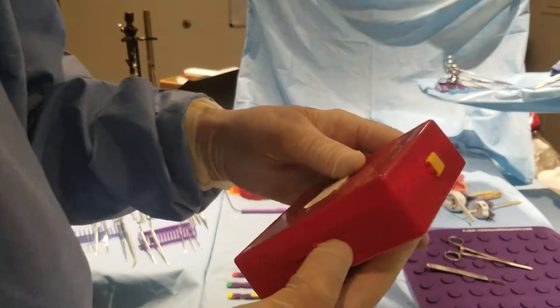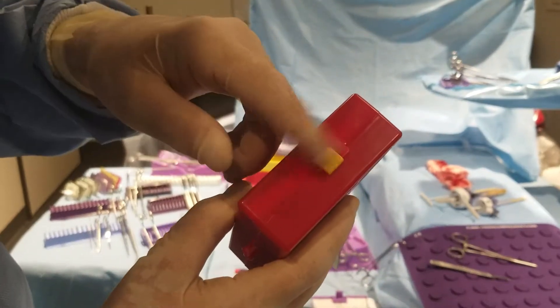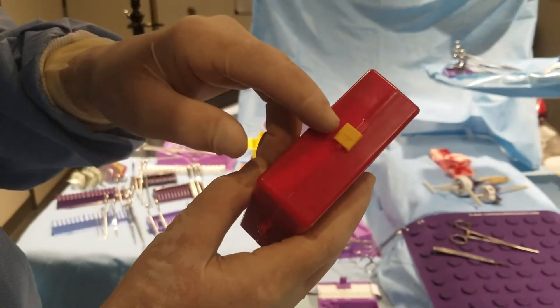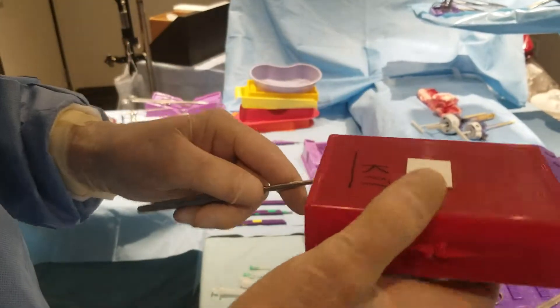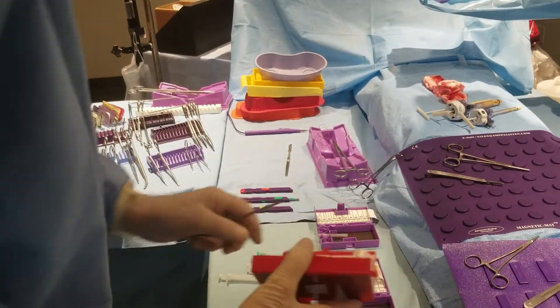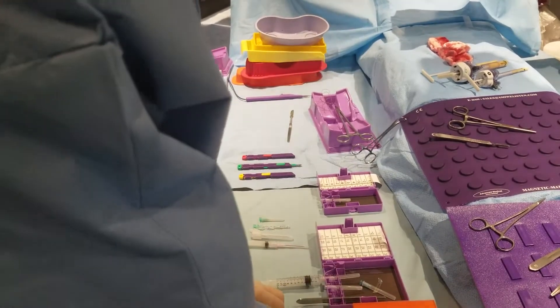Furthermore, those tabs are not x-ray detectable, and they can come off, go into the patient's wound with particulate matter, which is not x-ray detectable, and create complications. So nurses do not use those tabs, and they are just being wasted, because it was not necessary for them to be there.